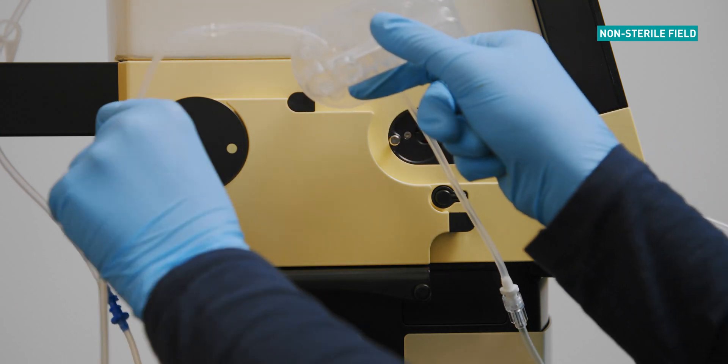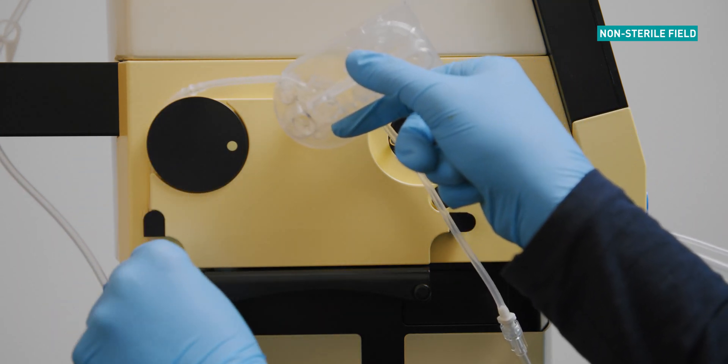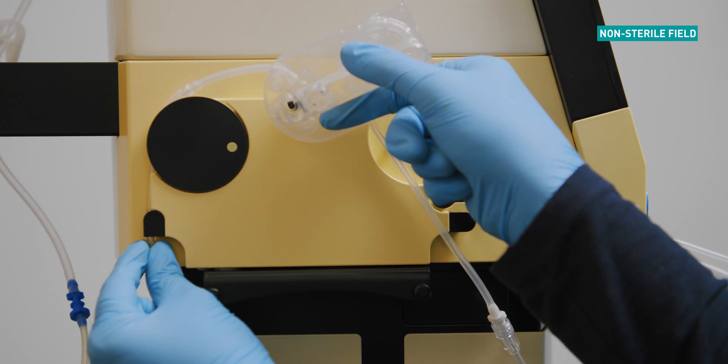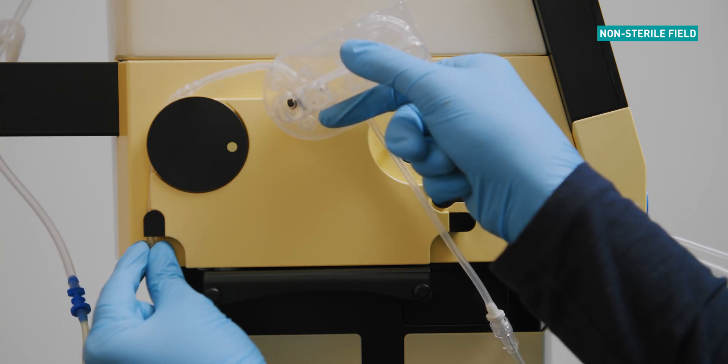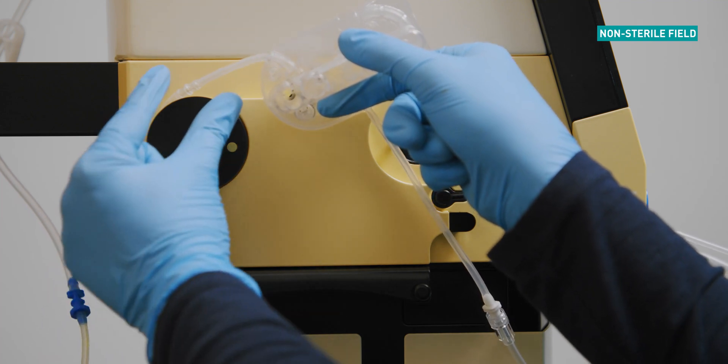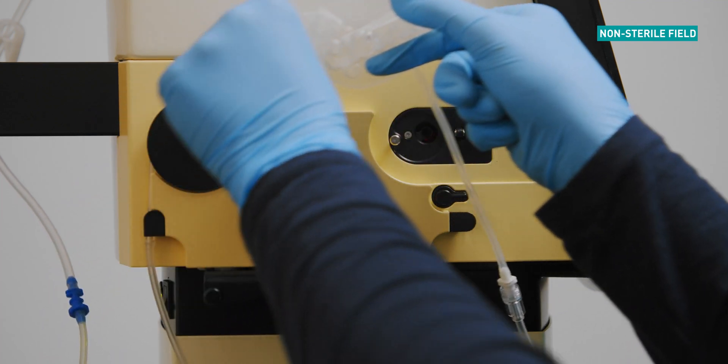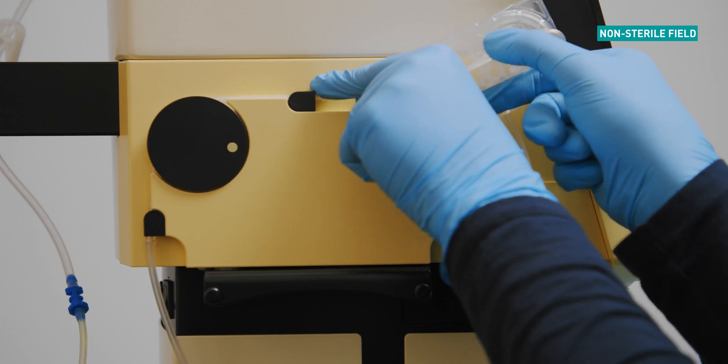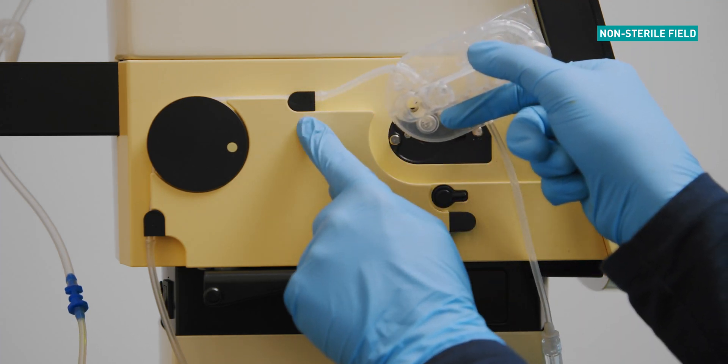Insert the locking mechanism into the first holding mount. Right hand holds the cassette and left hand makes a loop with the aspiration line. Grasp the second locking mechanism and gently pull the tubing over the pump wheel and secure into the second holding mount.